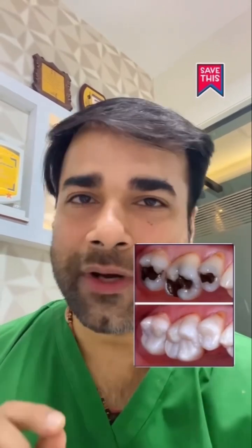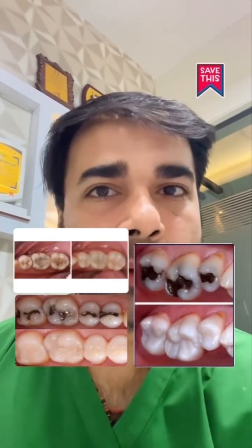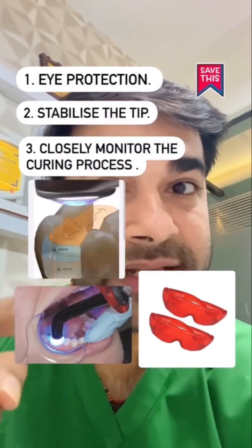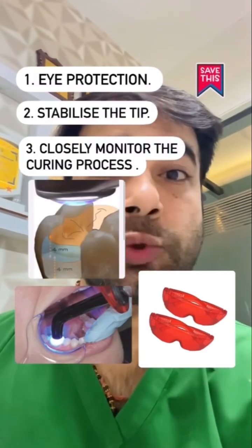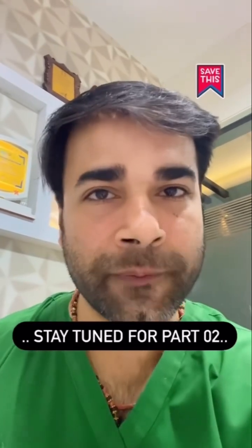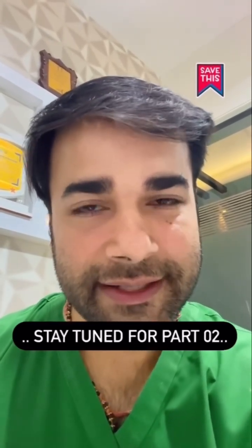On the brighter side, proper light curing techniques can double your bond strengths, leading to better outcomes for your patients. So always wear eye protection, stabilize the tip, and closely monitor the curing process to ensure optimum results. Stay tuned for part 2 — don't forget to share it and save it. Take care.